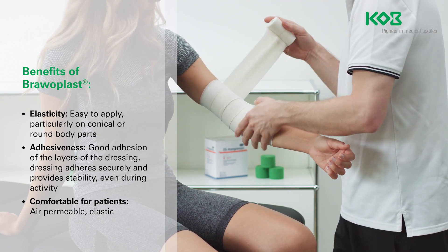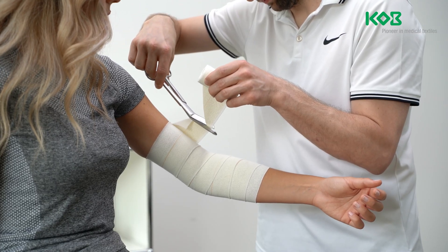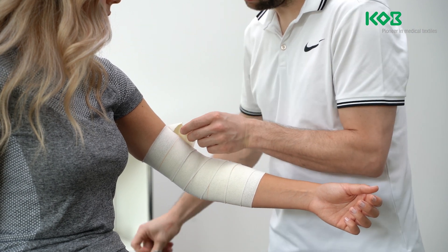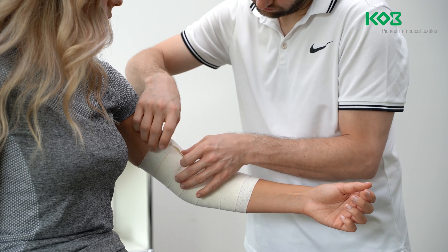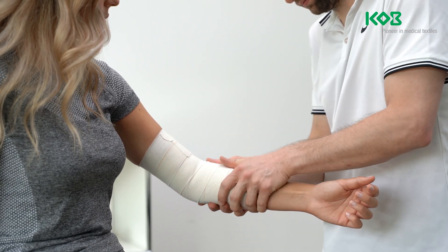At the appropriate point, cut the bandage and press the end of the bandage and the entire dressing on with your hands. The ends of the bandage do not need to be fixed. The dressing should fit well but not be too tight and have as few wrinkles as possible.